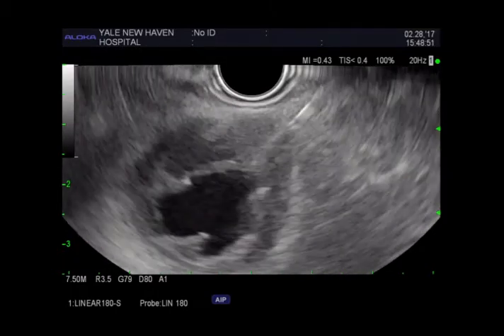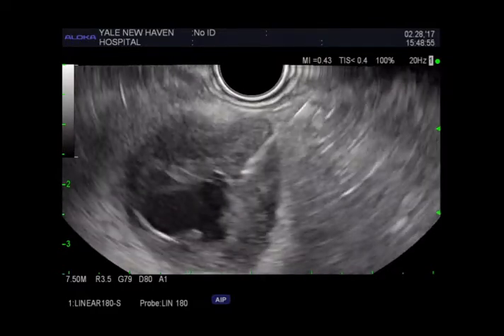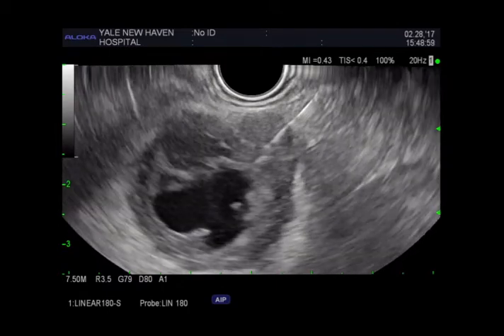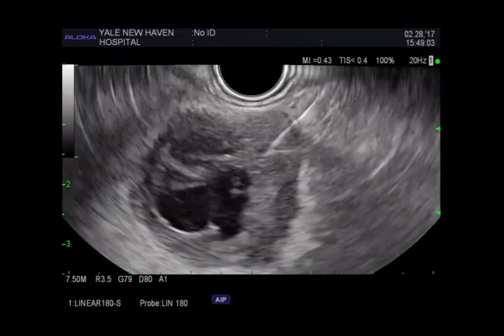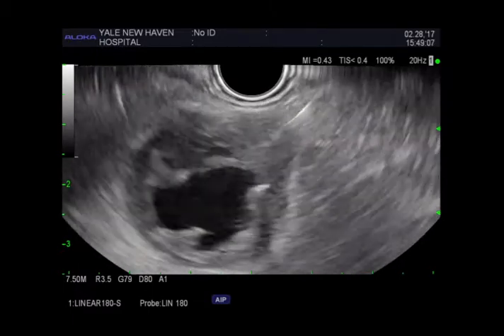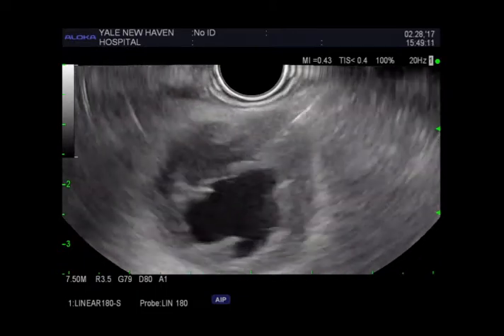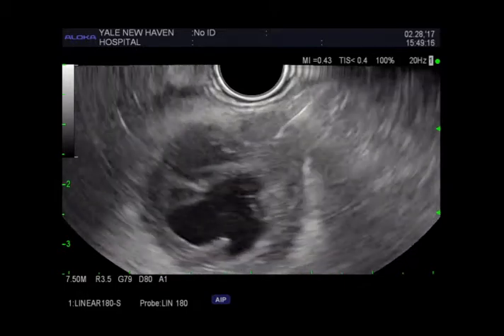Although a 22-gauge needle is typically utilized for cyst fluid aspiration, a 25-gauge needle works well to target a thickened cyst wall and obtain a cellular sample. The needle is moved within the wall without entering the central fluid portion. There is often limited cellularity within that fluid. Repeat sampling of the fluid with the same needle should be avoided to reduce infection risk.